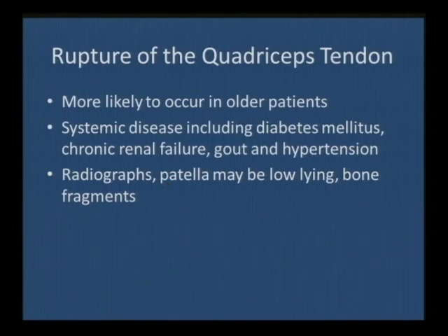Usually a patient presenting to the ER, it's thought clinically there's probably a quadriceps tendon rupture, or it's thought on a radiograph there's probably a quadriceps tendon rupture. It's very easy to bring the patient up from the ER and scan the quadriceps tendon.